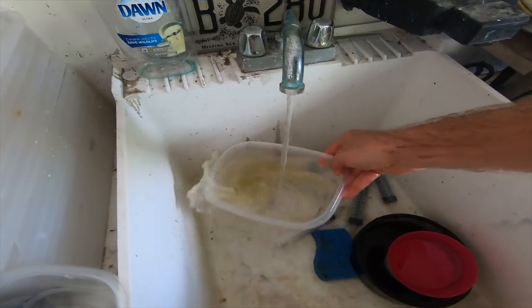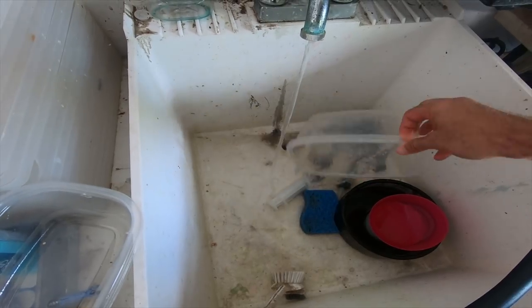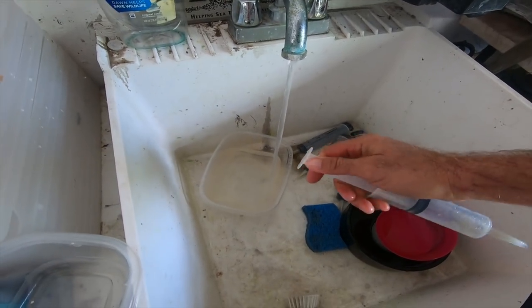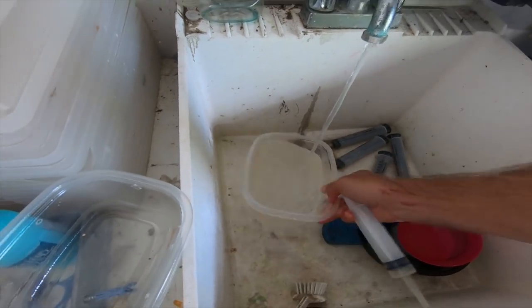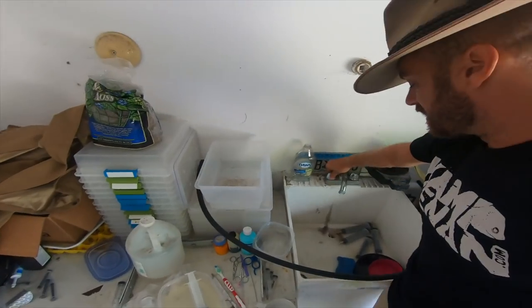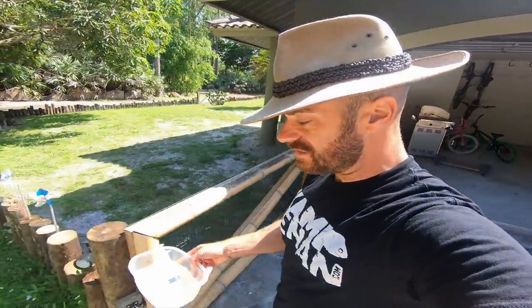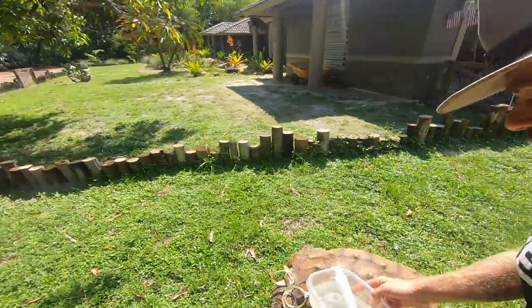This is just a little work area that I have. But the water's clean. And you also don't have to worry too much about keeping things completely sterile. You want to make sure it's not too hot. Water about 90 degrees, that should be enough water. What I was going to also say, guys, is the gut is not a sterile environment, so the water out of the sink is going to be fine. Not a problem. So we're going to do this real quick.